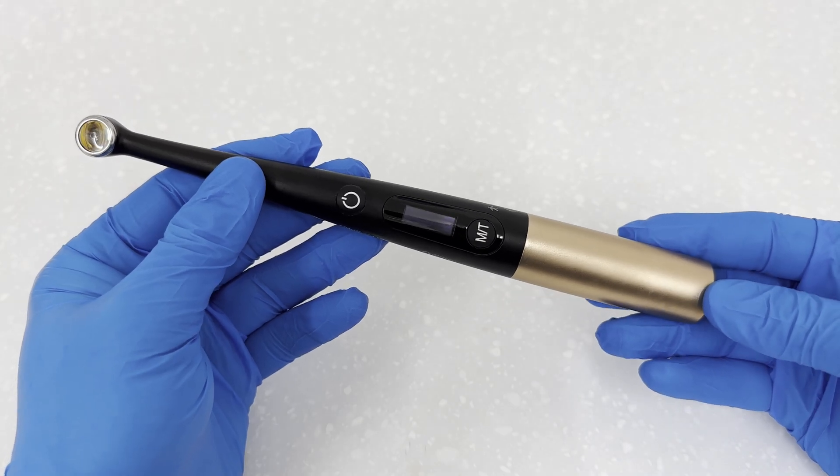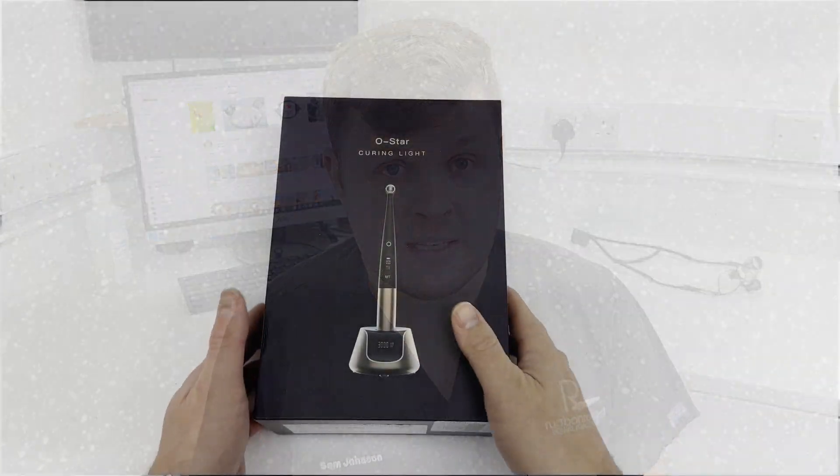Welcome again to another review. This is the Ostar curing light. Although this product is not entirely used for endodontic treatment, I will prove in this video it has a few tricks up its sleeve, including an amazing crack detection feature. So let's get started with the unboxing.